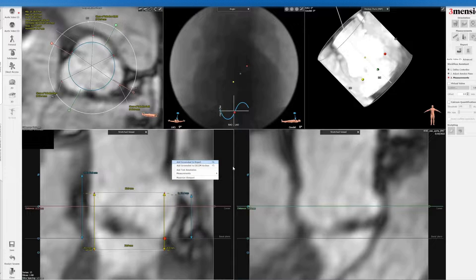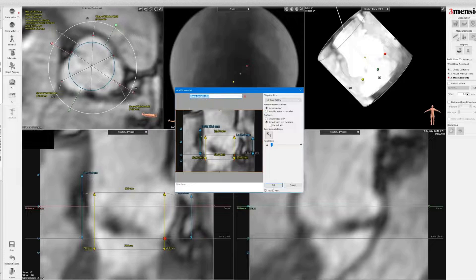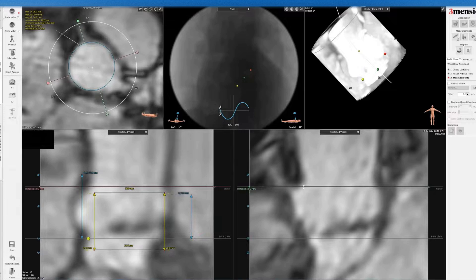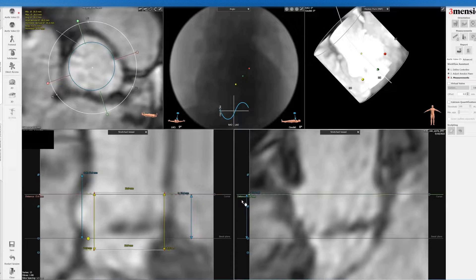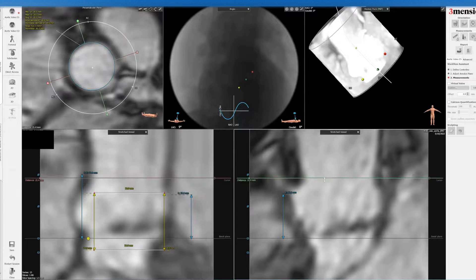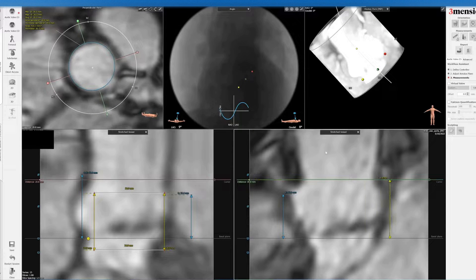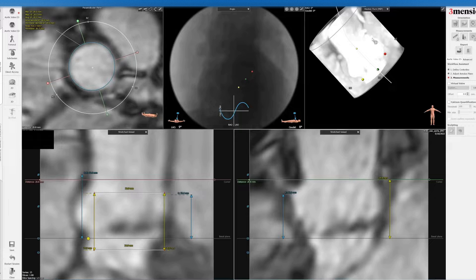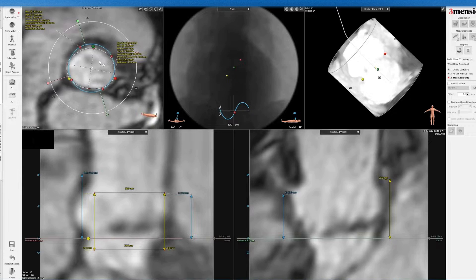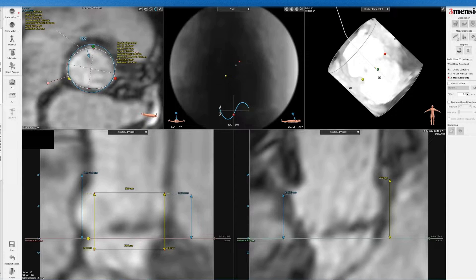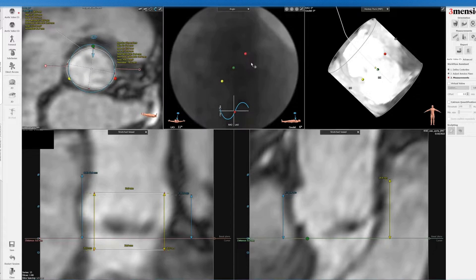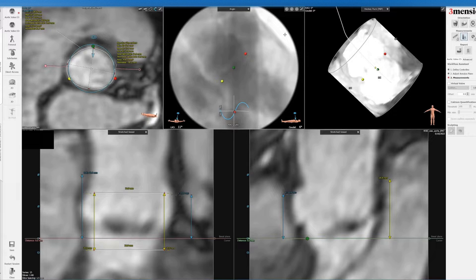Here I'm going to look at the left main view. You can then scroll up to identify where the right coronary takeoff is — right here — with the solid green circle. Right click to save the right coronary height — this is the right sinus height. Right click to save the screenshot. Now you're not going to be able to see the hockey puck view or the coplanar aortic view because this is an MRI study. However, you can get the angle by going to the C-Arm icon, clicking and overlaying onto the green dot. You can still get an idea of what the root angle and the implant angle are.